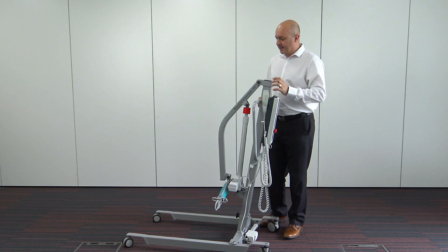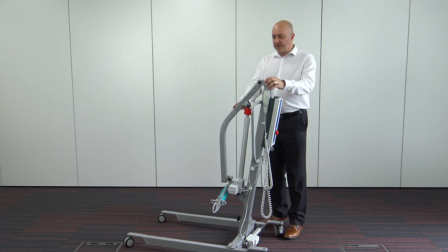Hi and welcome to the video. We're going to be running through the Mackwith Essentials 180 hoist, just a few of the features and functions of the hoist. Manufactured in our Mackwith factory, it's an Essentials 180.